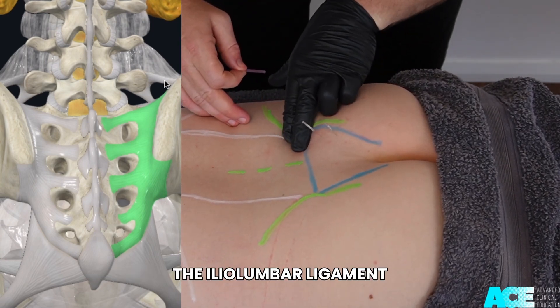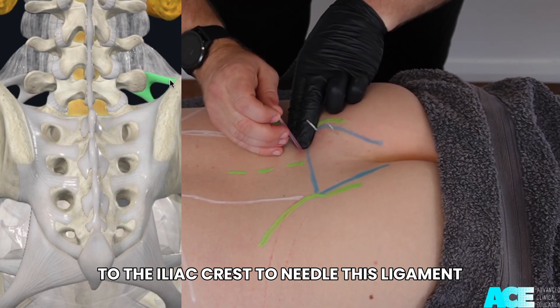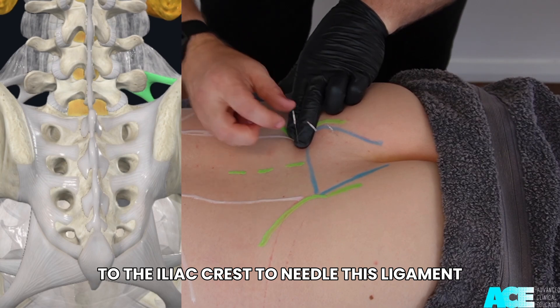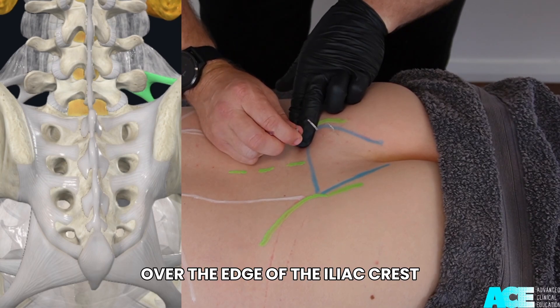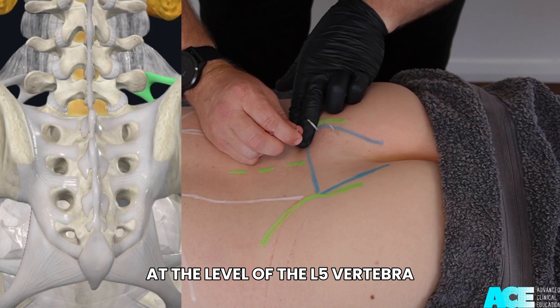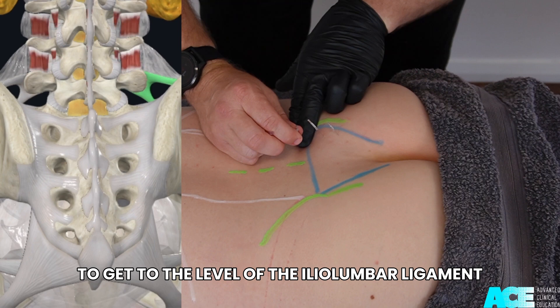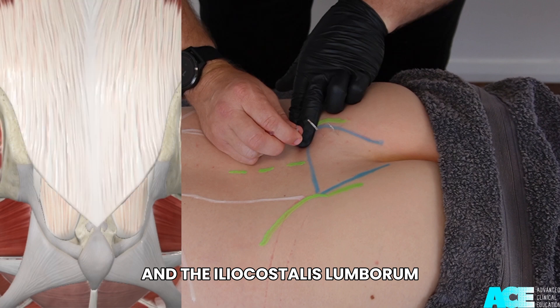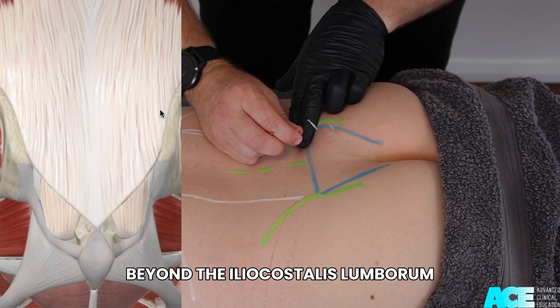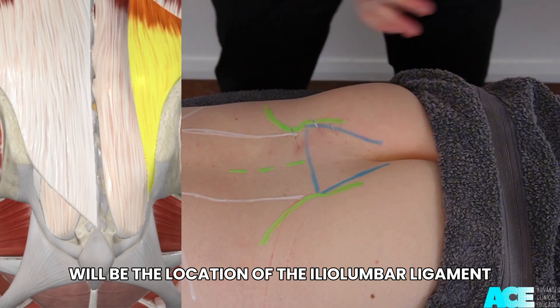The iliolumbar ligament connects the transverse process of the L5 vertebra to the iliac crest. To needle this ligament, direct your needle in a posterior to anterior direction over the edge of the iliac crest at the level of the L5 vertebra. To reach the iliolumbar ligament, you will need to pass through the thoracolumbar fascia and the iliocostalis lumborum. Beyond the iliocostalis lumborum will be the location of the iliolumbar ligament.